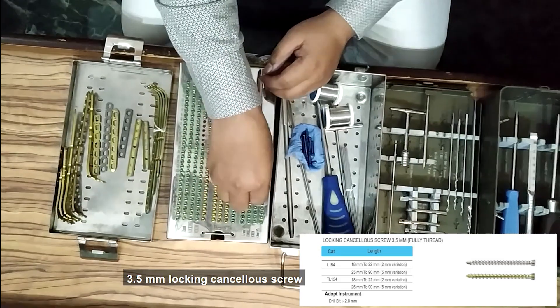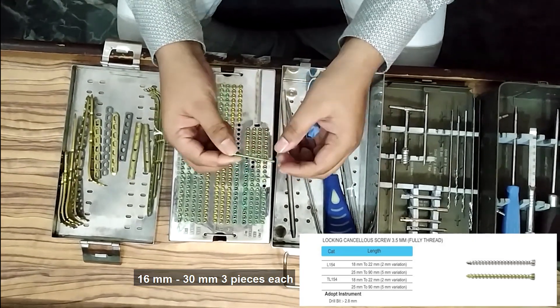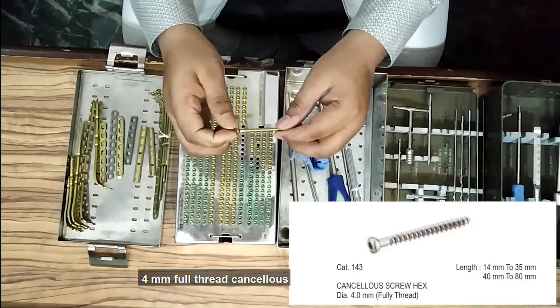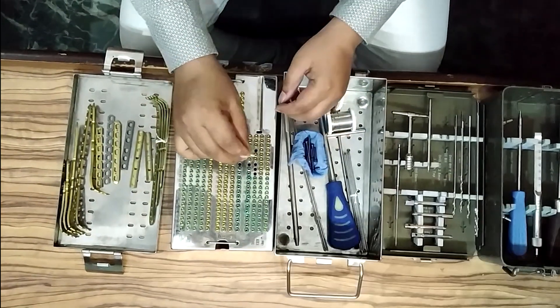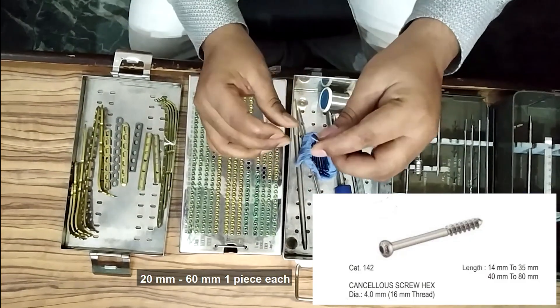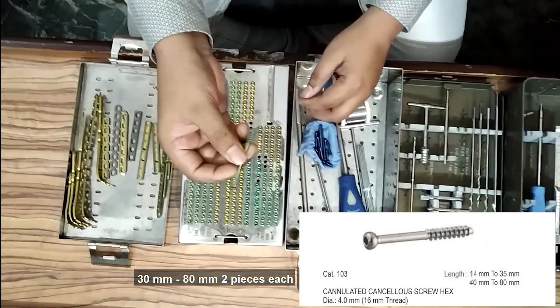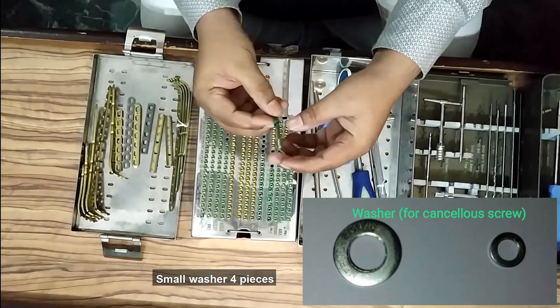3.5 mm locking cancellous screw: 16 mm to 30 mm, three pieces each. 4 mm full thread cancellous: 40 mm to 60 mm, two pieces each. 4 mm short thread cancellous: 20 mm to 60 mm, one piece each. 4 mm cannulated cancellous: 30 mm to 80 mm, two pieces each. Small washer: four pieces.